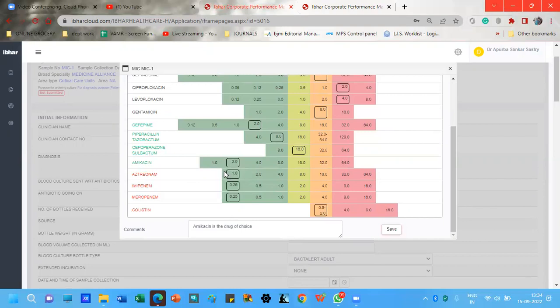What about these ones? The imipenem, meropenem, aztreonam. This is what we call off-scale MIC or limiting dilutions. So Vitek includes MIC ranges testing from 0.25 to 16. Because the most susceptible MIC the Vitek tests is 0.25, it cannot detect less than that.